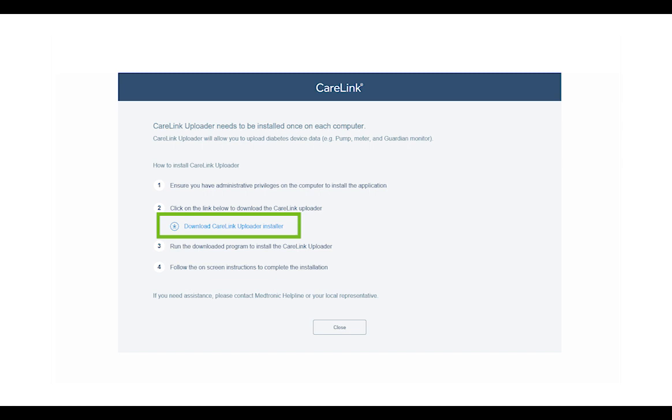Double click on the downloaded file to start the installation. You may need to have full access to change your computer settings, also known as administrator rights. You may also be asked to enter your computer's login password.